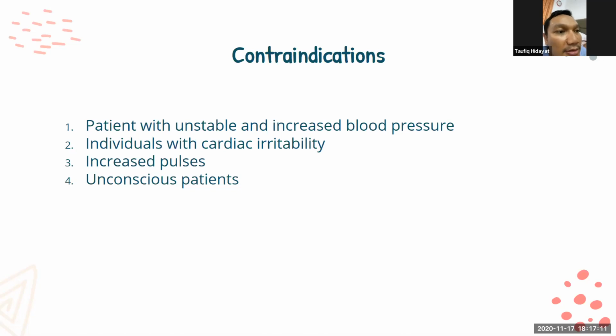With a nebulizer you can give 2.5 to 5 milligram, which is 25 to 50 times more than the MDI. So that is only for rescue, in a very severe situation. But if the patient is stable and responds to MDI, we use MDI.